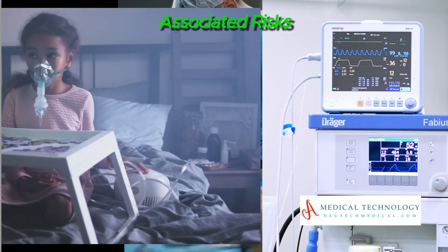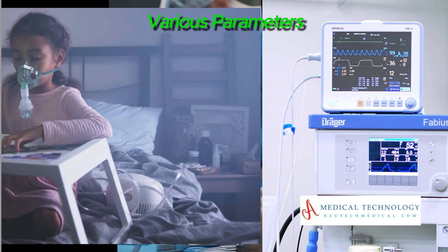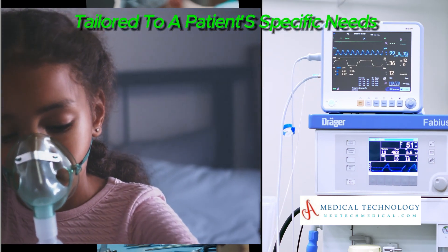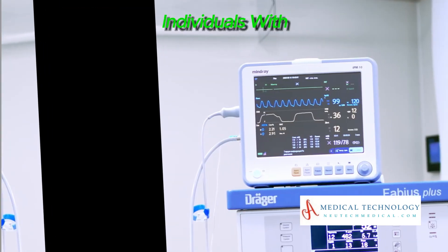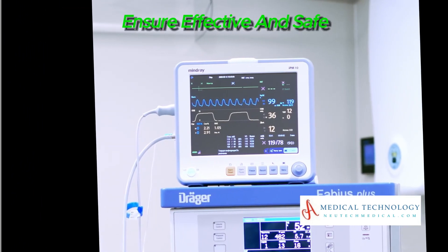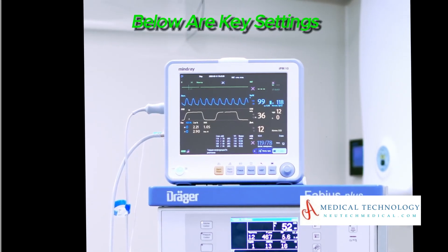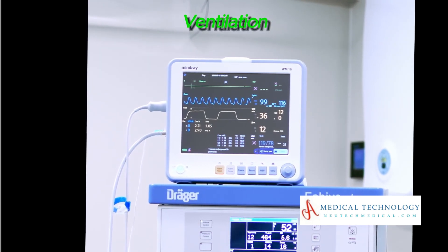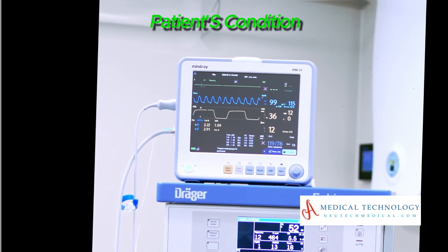Setting up a ventilator involves configuring various parameters to deliver mechanical ventilation tailored to a patient's specific needs. Ventilators are crucial in supporting individuals with respiratory insufficiency or failure; proper settings ensure effective and safe ventilation. The first key setting is mode of ventilation — select the appropriate mode based on the patient's condition.